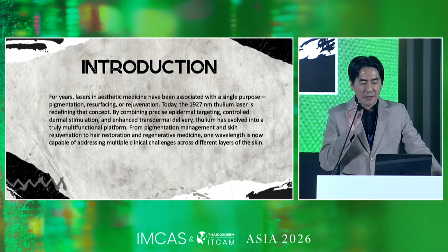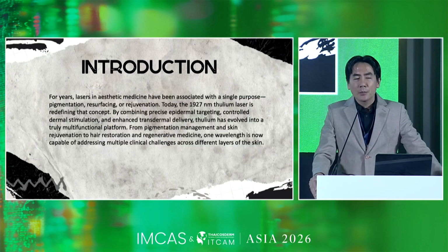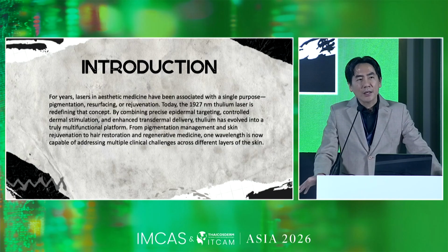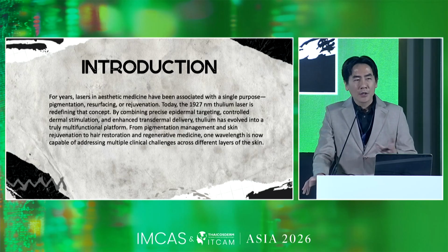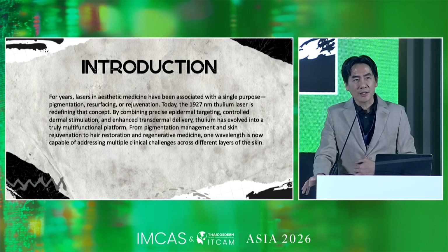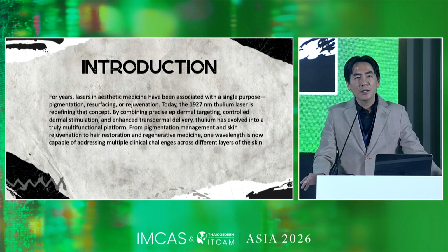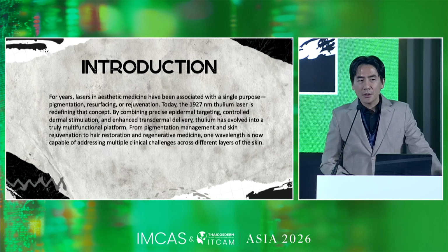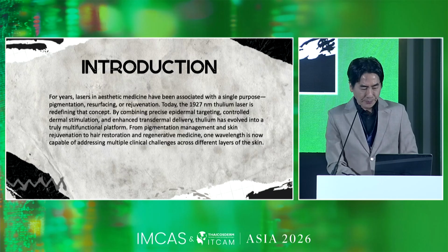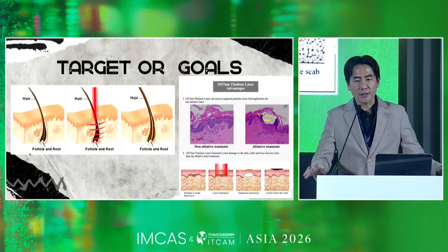Why do I say it's a multifunctional laser? I'm going to explain it in detail. But I like, for example, the long pulse Nd:YAG laser, which is also an underrated laser. The thulium laser is also an underrated laser. But if we know it in detail, it can work for many things, and it gives us plenty of options. It gives us plenty of choices to treat our patients. So it's redefining how we use lasers lately.